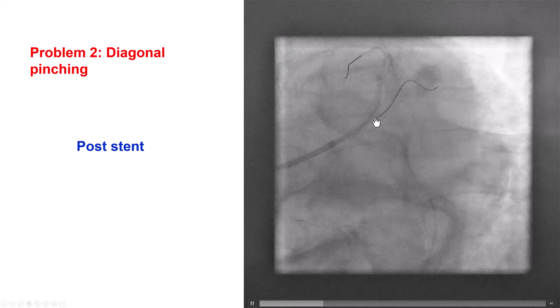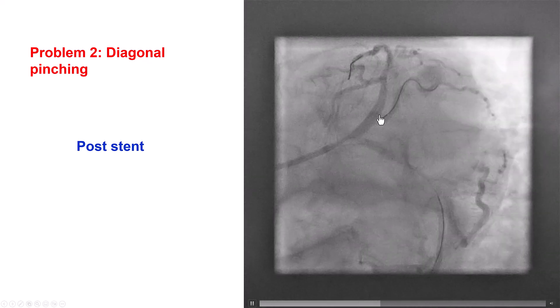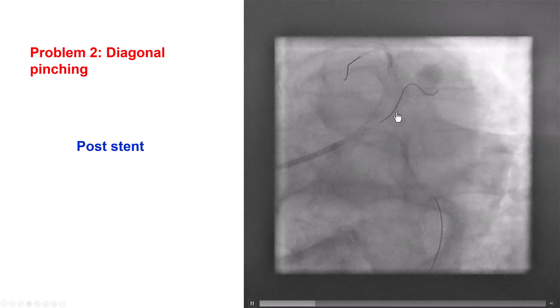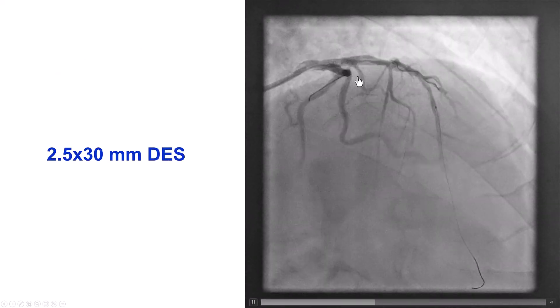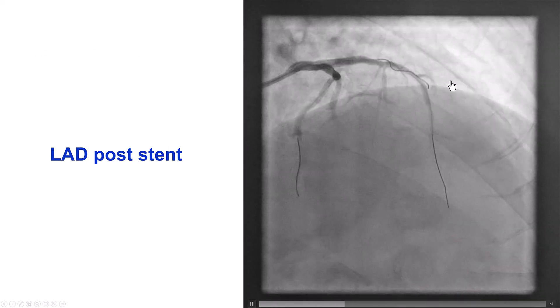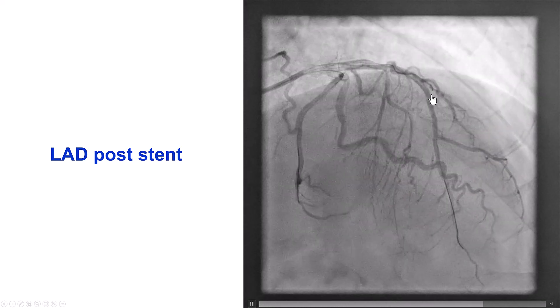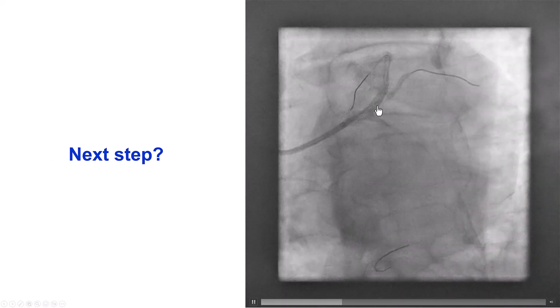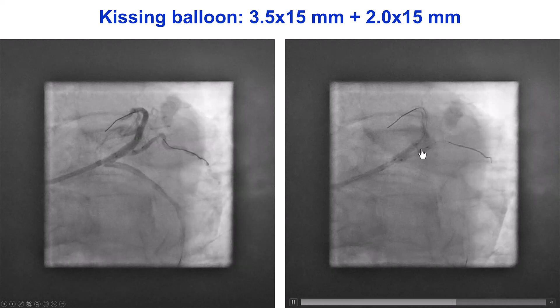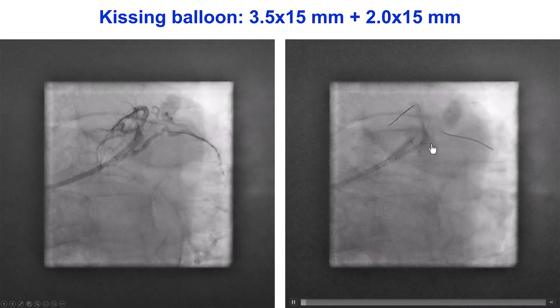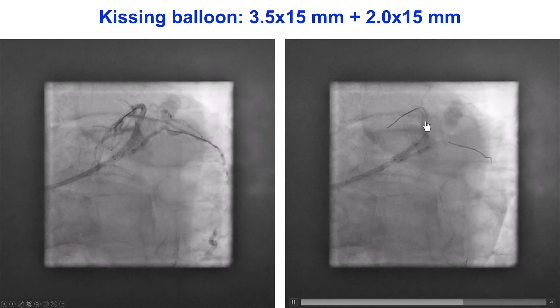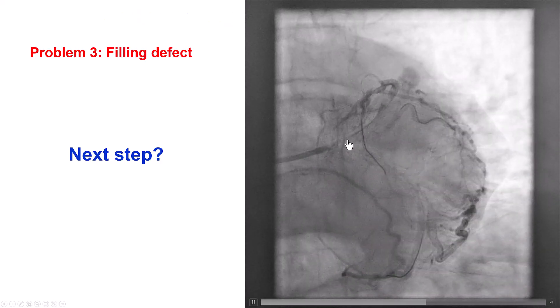However, there is another problem now: we have pinched the ostium of the diagonal branch. So this is an example where one complication brings another. We decided to first treat the LAD, placing a 2.5 by 30 mm stent across another diagonal branch; however, there was no cessation of flow in the diagonal. We then decided to treat this by ballooning the side branch rather than placing a stent in this smaller branch. We rewired the vessel, and then a kissing balloon inflation with a 3.5 mm into the LAD and a 2.0 mm into the diagonal branch gave a satisfactory result.